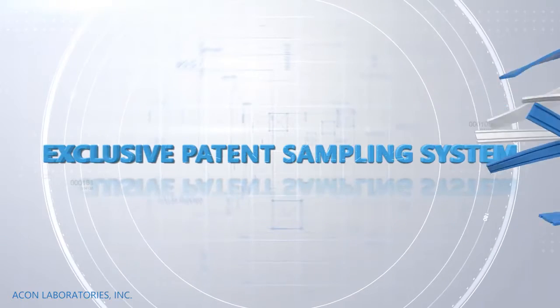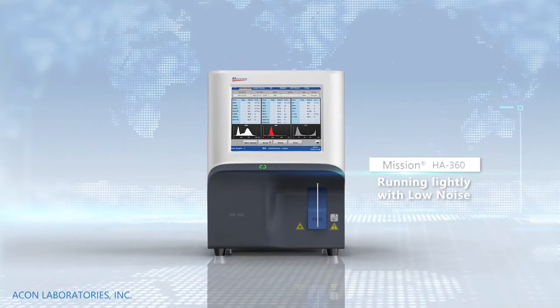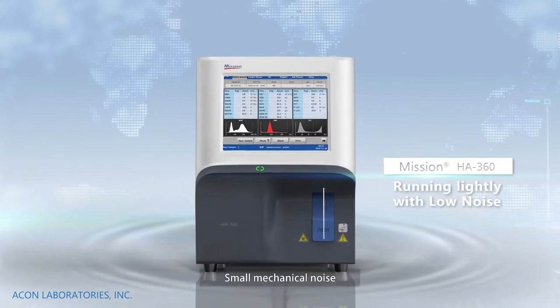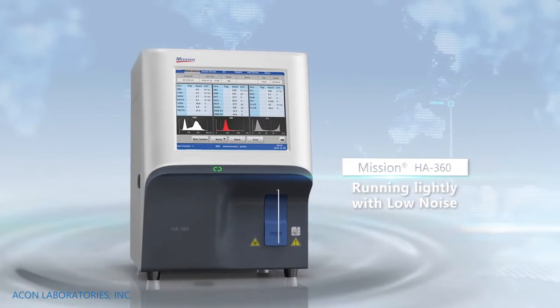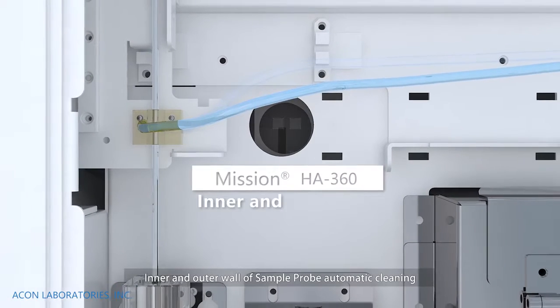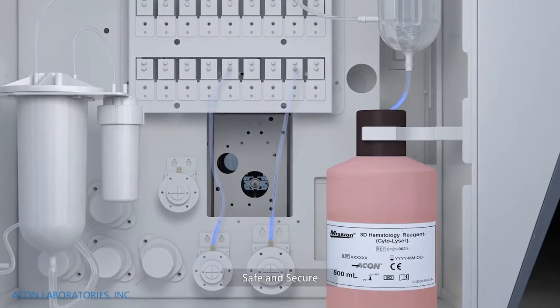Exclusive patent sampling system. The machine runs light with compact space and small mechanical noise. Open sampling supported. Inner and outer walls of the sample probe are automatically cleaned. Safe and secure.